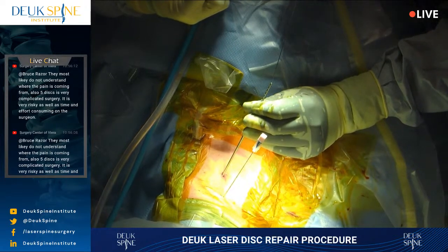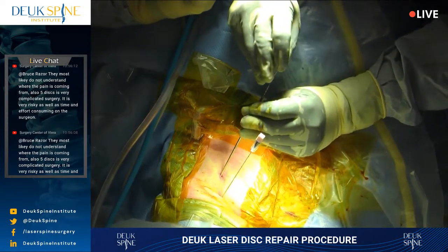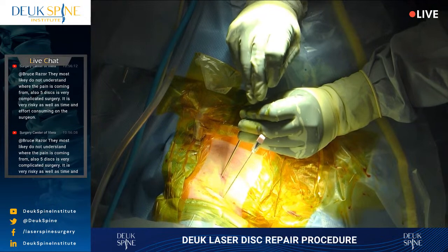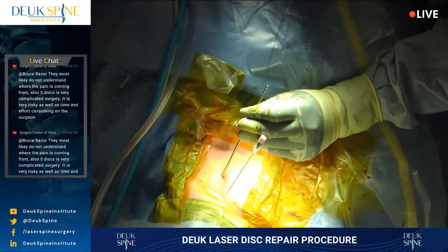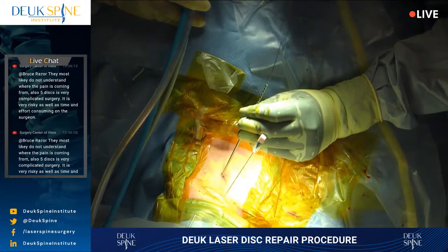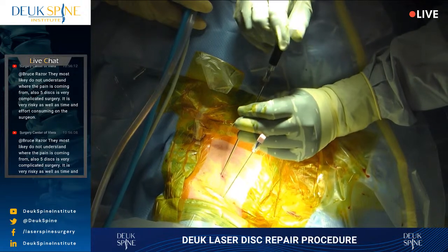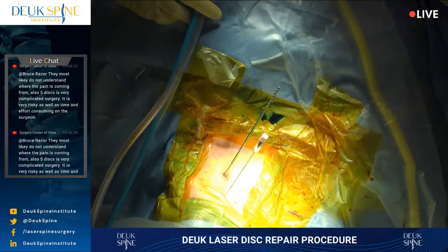Have that ready. Shot. Shot. Just a lot of arthritis in this space. Feel like a lot of scar tissue here. I can feel it at the back of the disc. Shot. Huh. Just doesn't want to come out. All right, let's do this. Give me a better view.